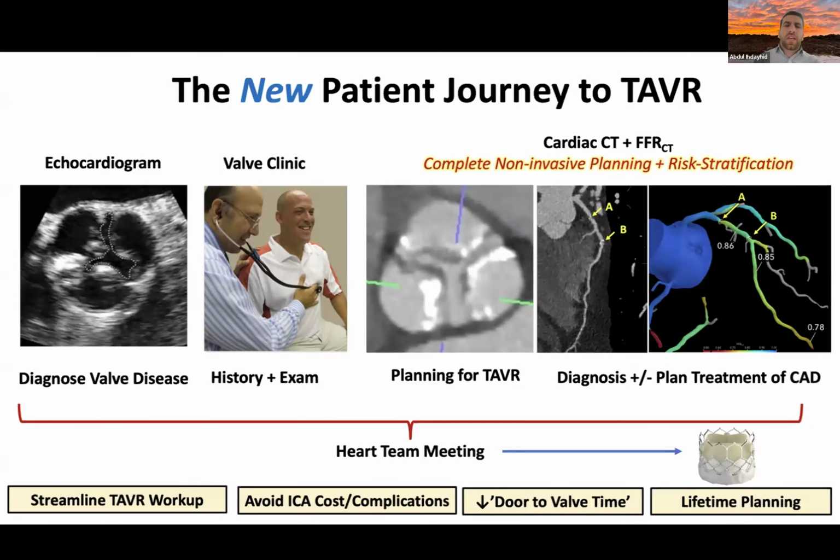And certainly, if we can remove the invasive angiogram as part of the routine journey, particularly given that the vast majority of patients don't get PCI, we think there could be benefit to streamlining the process, reducing cost and complications, and reducing the door to valve time. And cardiac CT with FFRct has some promise in providing non-invasive planning and risk stratification. And we certainly look forward to sharing some of our results at TCT.